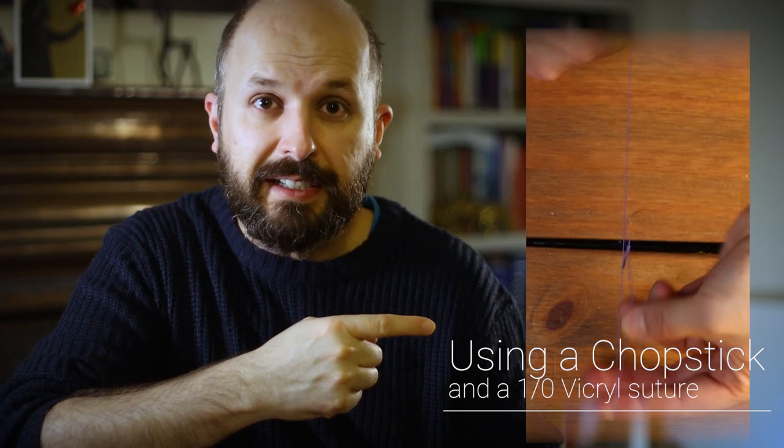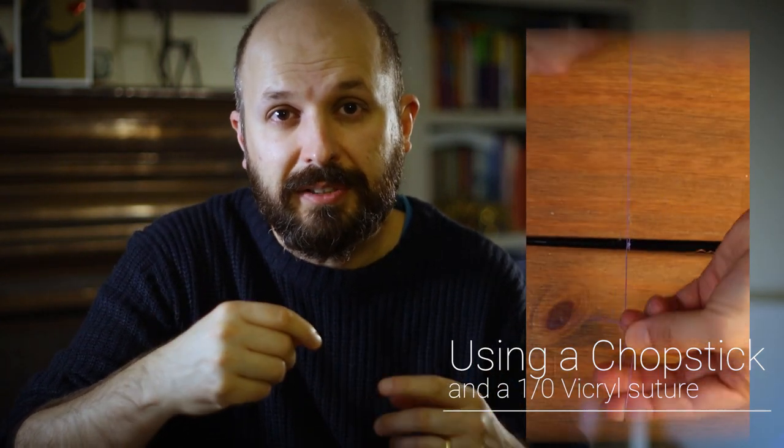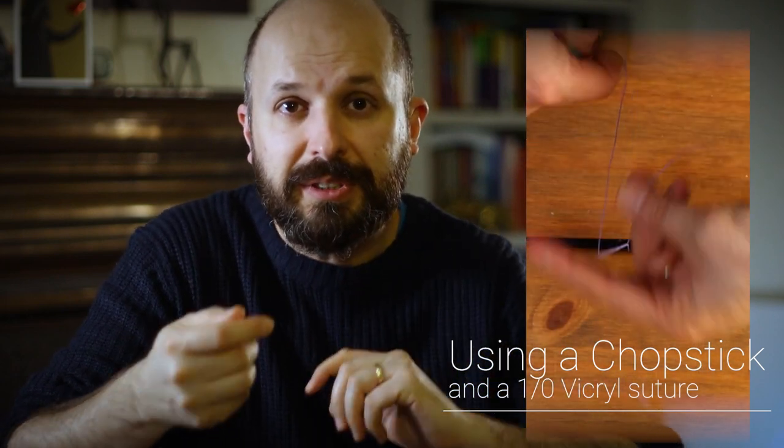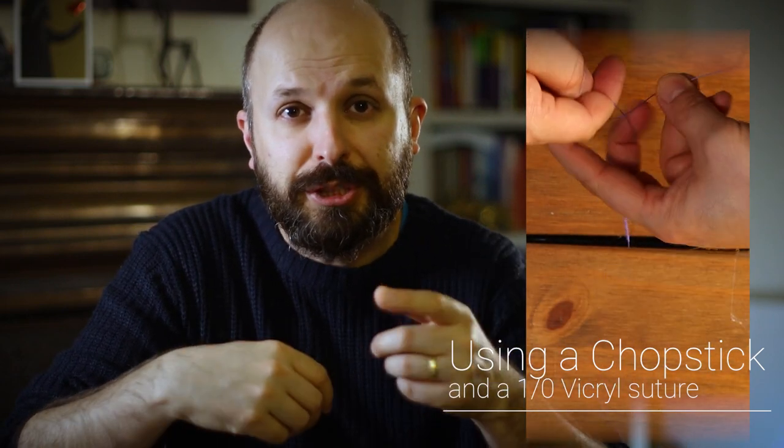You'll see from the video just about here that there are actually two different parts of this tying technique, and so although it looks like I'm doing the same thing going backwards and forwards, it does actually slightly alter as you do each one.